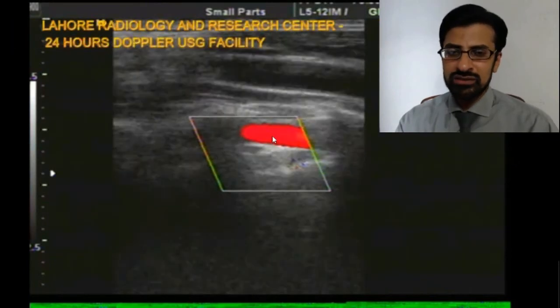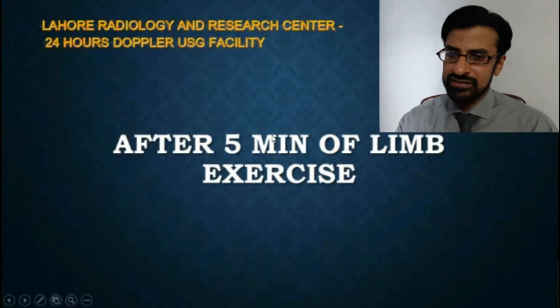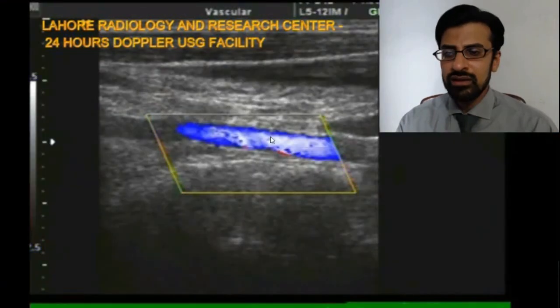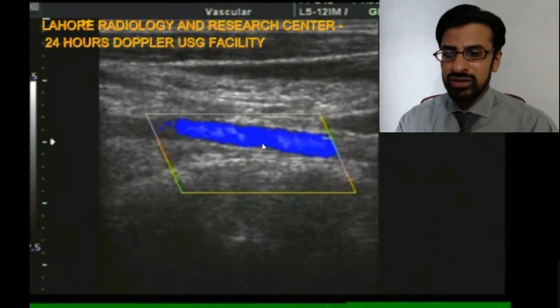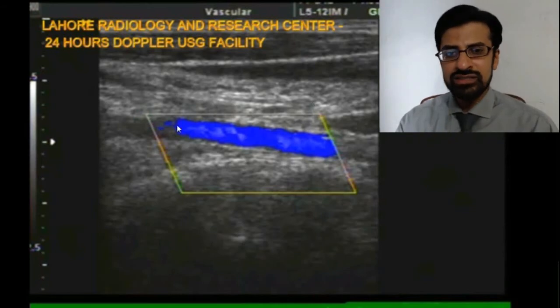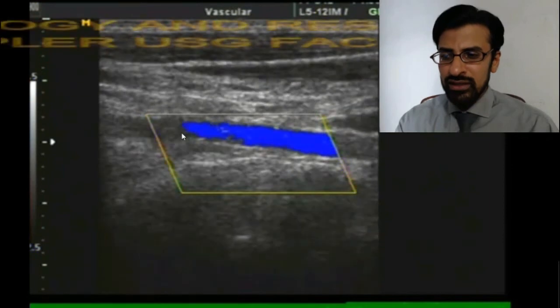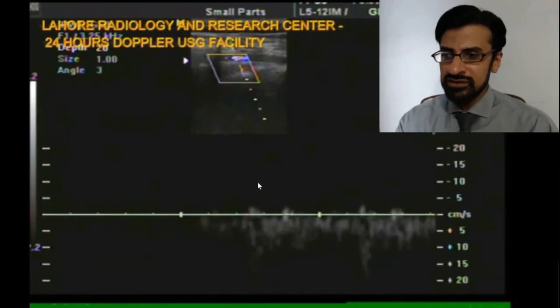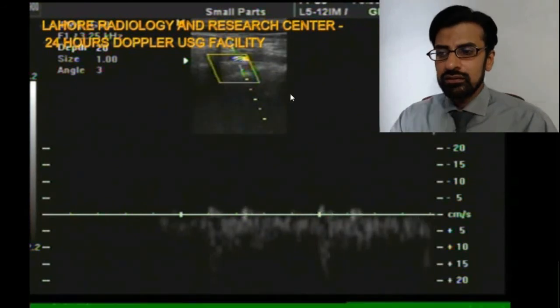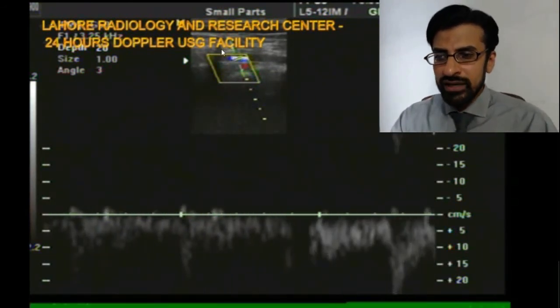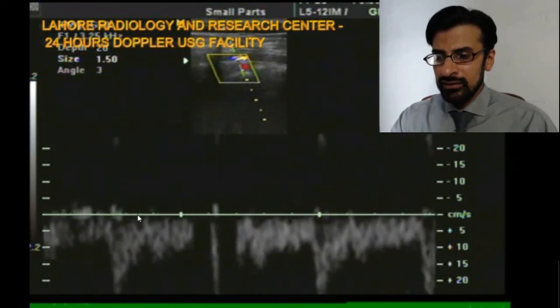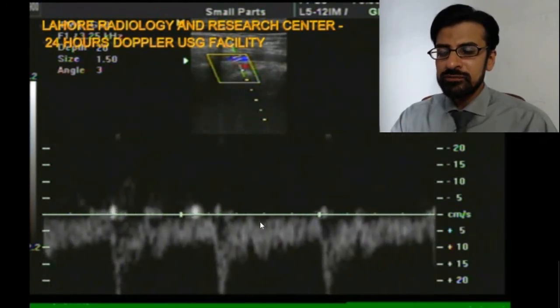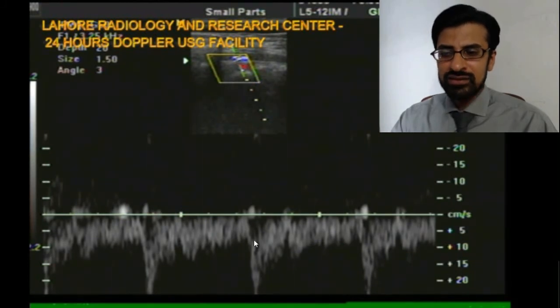This patient was asked to exercise the upper limb for a few minutes. After five minutes of exercise, the study was repeated. The vertebral artery is now completely filled with blue color with the same settings of the color box, meaning blood is now flowing in the opposite direction — the direction of blood has completely reversed within the vertebral artery. When we applied pulse Doppler, it showed a waveform below the baseline, confirming complete reversal of the spectral waveform.